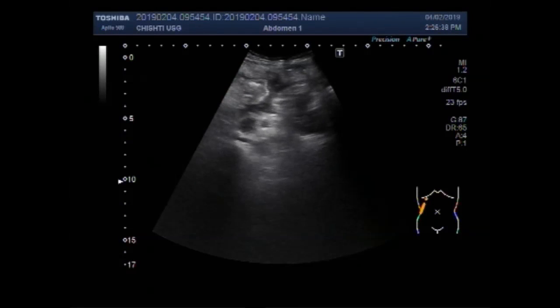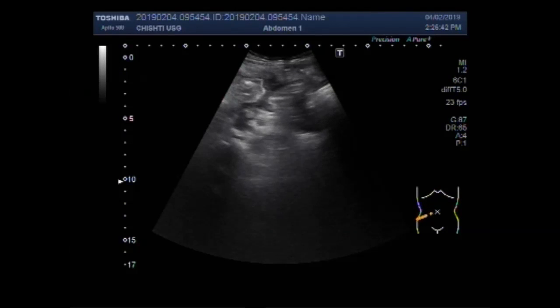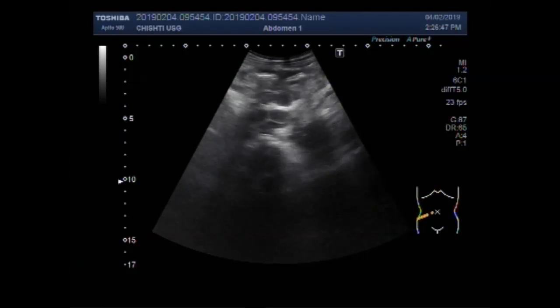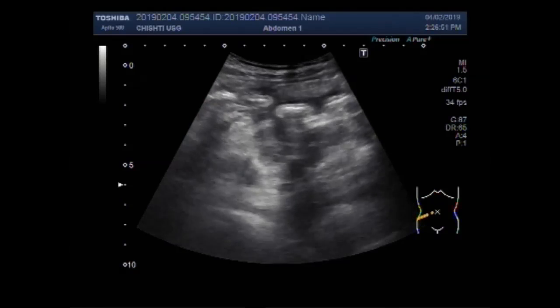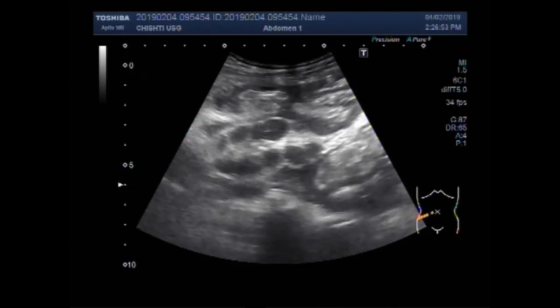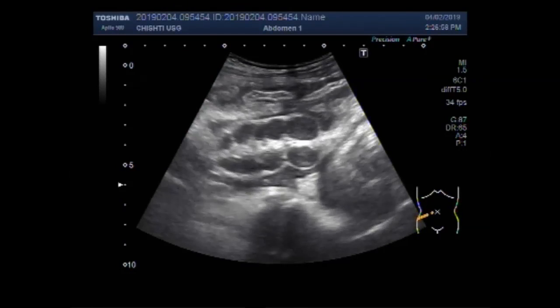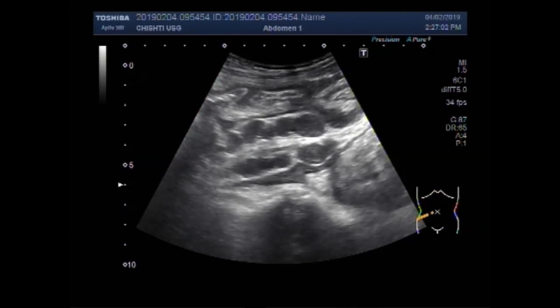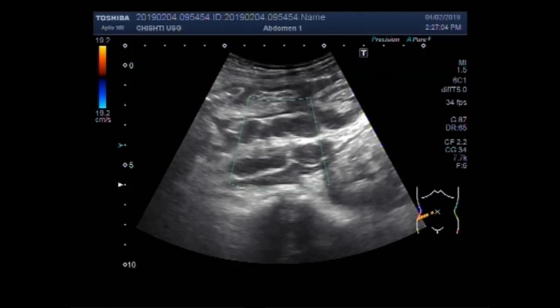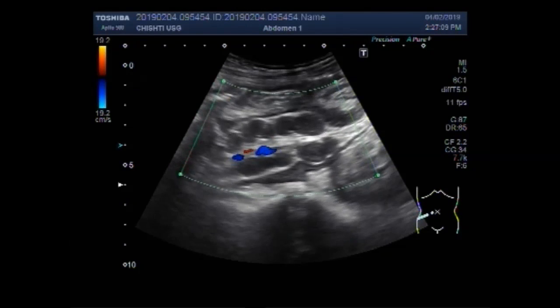Now you can see the fluid in between the gut loops in the middle portion of the abdominal cavity. The fluid is seen along with some prominent lymph nodes. These are the mesenteric lymph nodes.